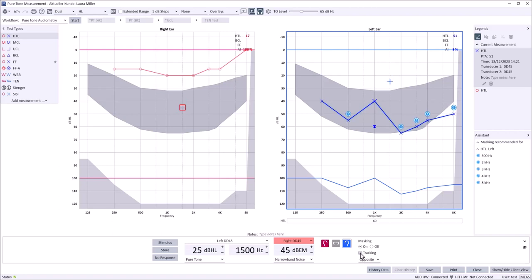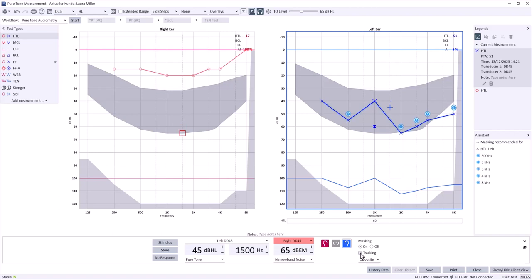Should bone conduction masking be necessary, simply select the appropriate transducer for each ear from the drop-down menus. For example, here we are presenting pure tone stimuli via the bone oscillator for the left ear and masking via supra-aural headphones to the right ear.